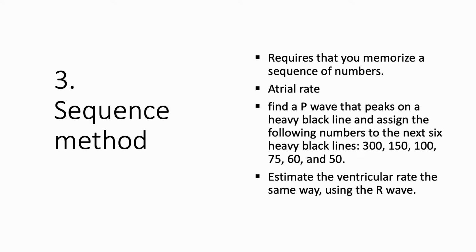Another way is the sequence method. This is the quicker way, and we use it in the wards. It is very easy to use and easy to remember. Just memorize this sequence: 300, 150, 100, 75, 60, and 50. So please remember this sequence of figures.